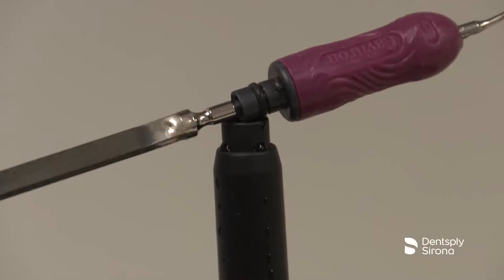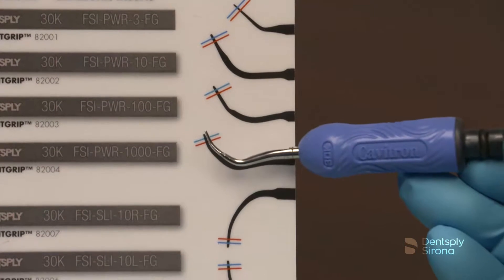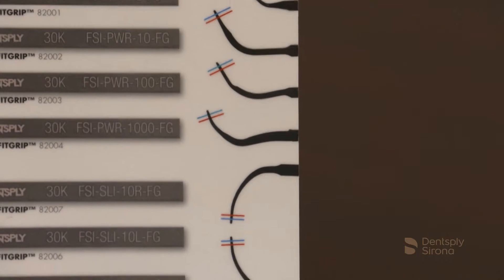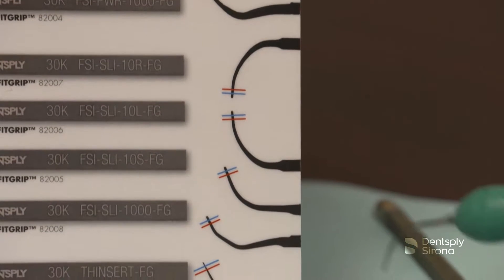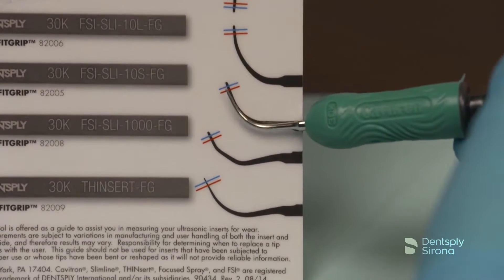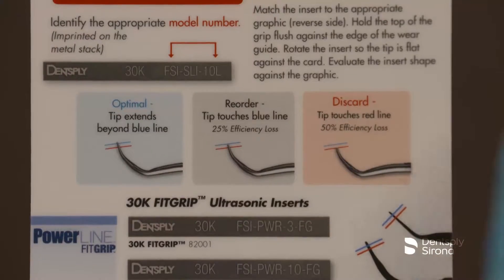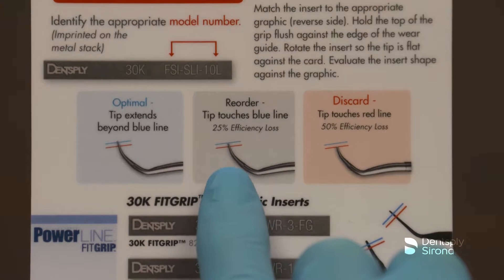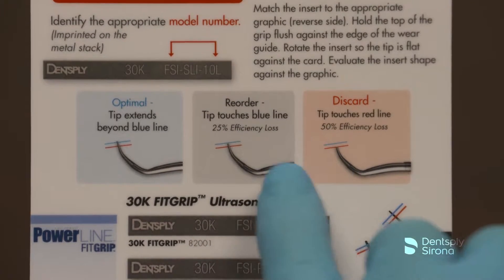Lubricate the O-rings with water before use. Monitoring the wear of your ultrasonic inserts is key to ensuring optimal performance. Using an insert that is excessively worn will cause it to operate at substandard efficiency and may cause the clinician to use excessive pressure while scaling, which results in discomfort for both the clinician and the patient. Inspecting the wear of your ultrasonic inserts routinely and replacing them when necessary can help maximize efficiency and comfort. Discard damaged, worn, or corroded instruments.